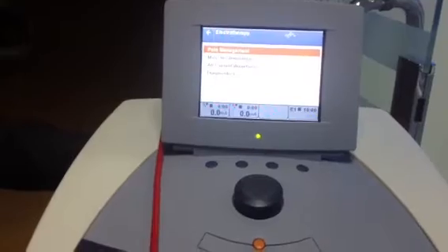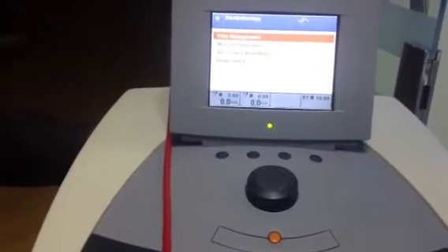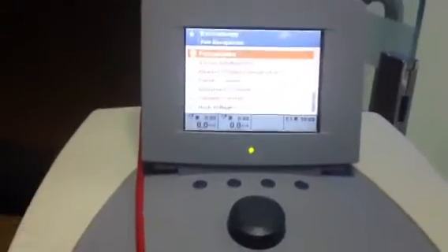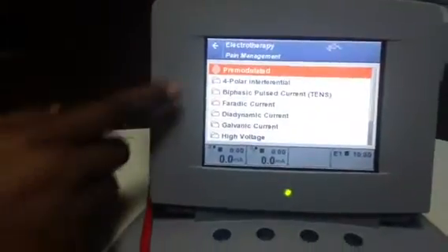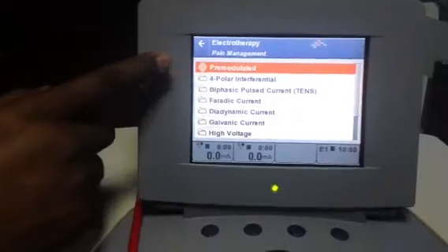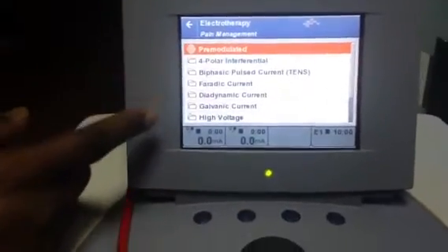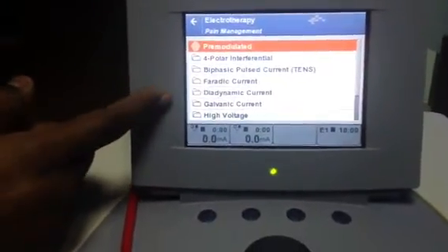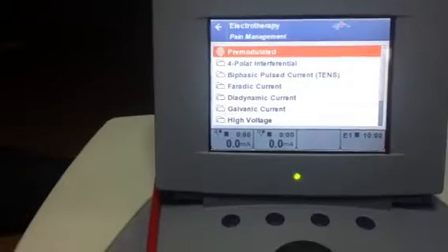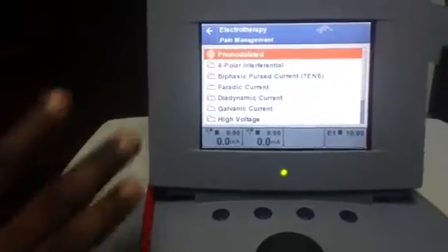In the Electrotherapy menu you have: Pain Management, Muscle Stimulation, All Current Waveforms, and Diagnostics. It depends on what you want. For example, if a patient comes for pain and you want to apply a current for pain, press Pain Management and select what type of current you want — premodulated, 4-polar, biphasic, or faradic.